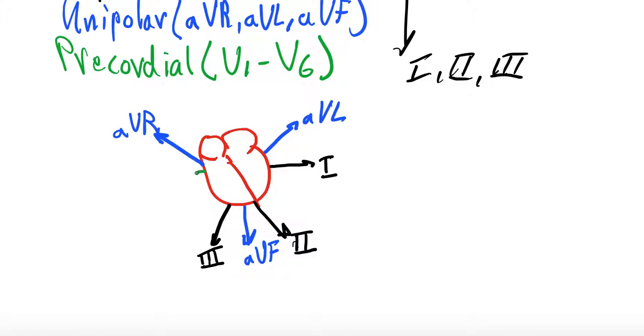Okay, and the last piece of this puzzle is going to be those precordial leads. So I'm going to again draw, this is our 3D ring, and we're going to have V1, and remember, these are going towards us, right? This isn't going down like lead 3 is. This is going towards us in the anterior-posterior plane.